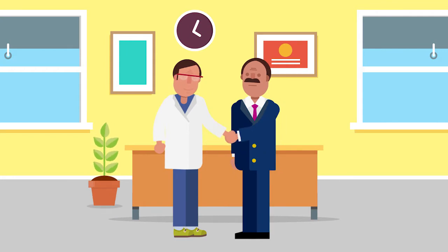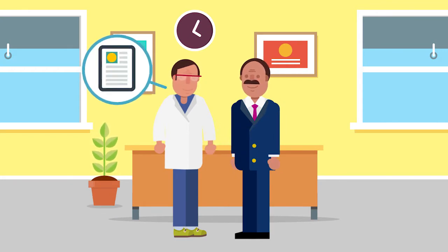Your doctor will also provide instructions on the follow-up care required at home and how to recognize complications in case they occur. Depending on the number and size of polyps found, as well as the quality of the bowel cleanout, your doctor will recommend when your next colonoscopy should be done.